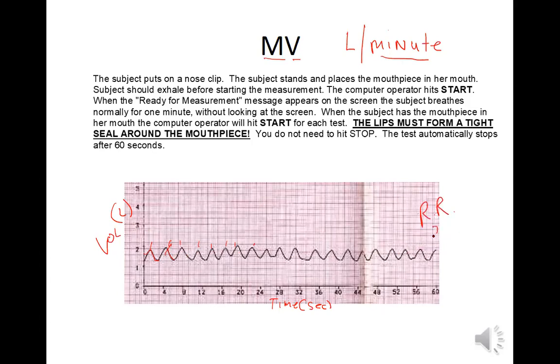So I think this is about 20 breaths per minute. So you have to have that to calculate the minute volume. And that's what this stands for, minute volume. I can't say stroke volume, but this is an average too. Like I would give you this number. You're not going to have to take every one of these tidal volumes and divide it by 20. So I would say I'm going to give you this. All these tidal volumes averaged together is 0.6 liters. That's your average TV over a minute. And this is the respiratory rate.